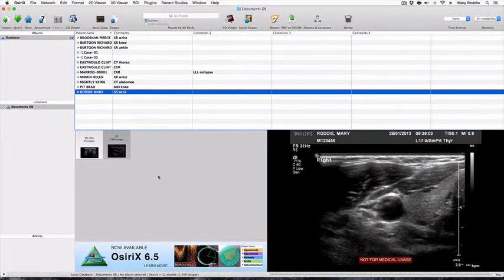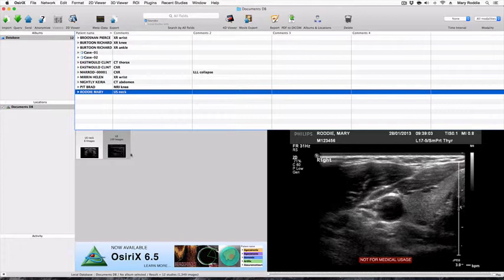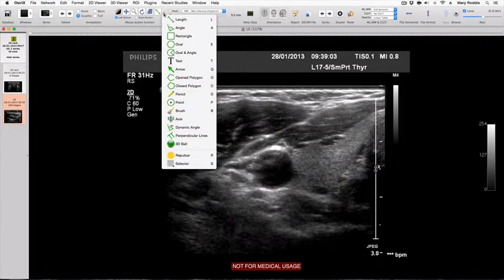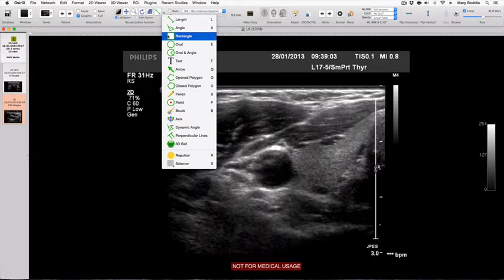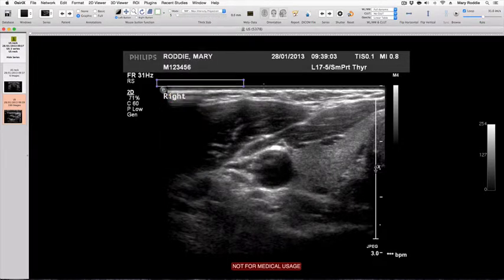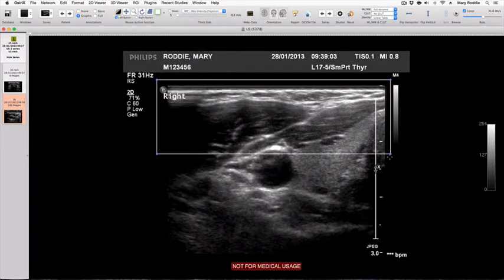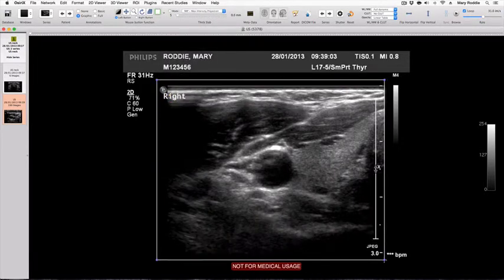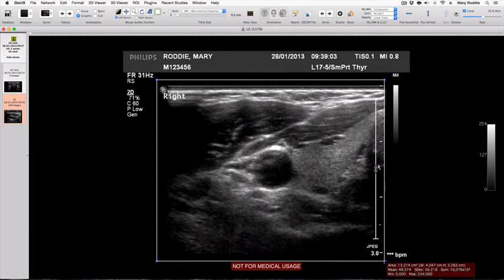Exactly the same process can be used for the larger series of 199 images. Again, we select the rectangular region of interest tool, draw around the area that we want to keep.